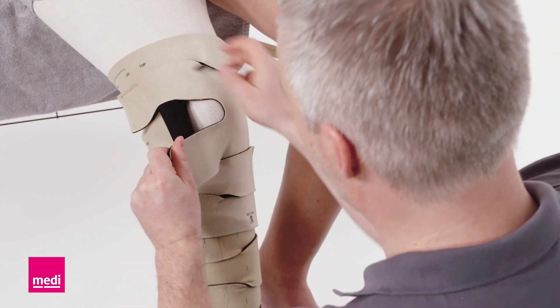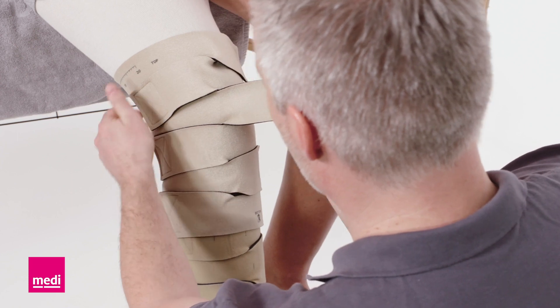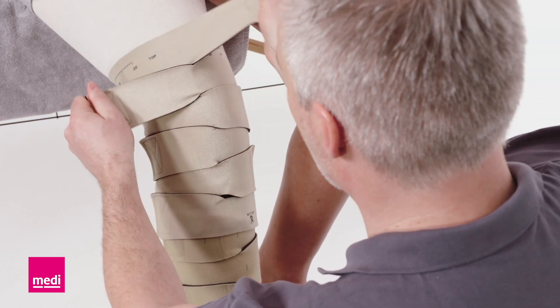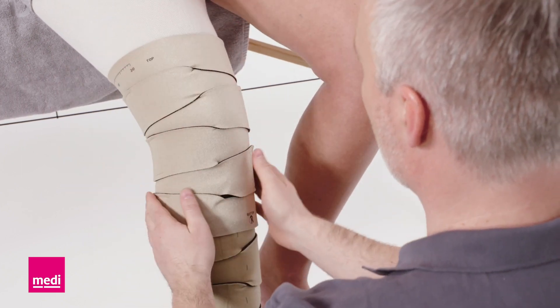Attach the bands alternately from bottom to top so that the garment lays flat and wrinkle-free. Slightly pull the upper band upwards to avoid wrinkles. Hold the top of the garment while attaching the last band.